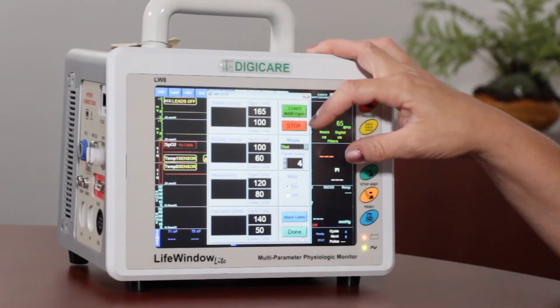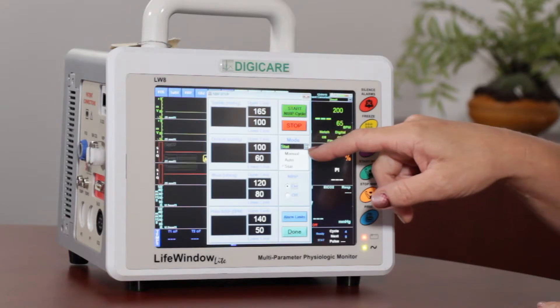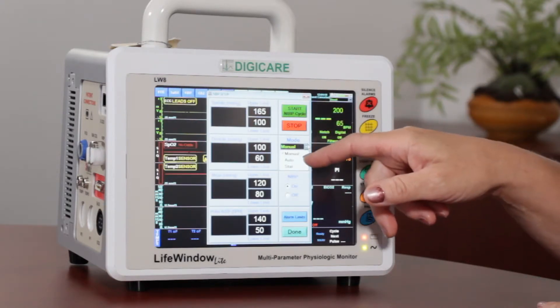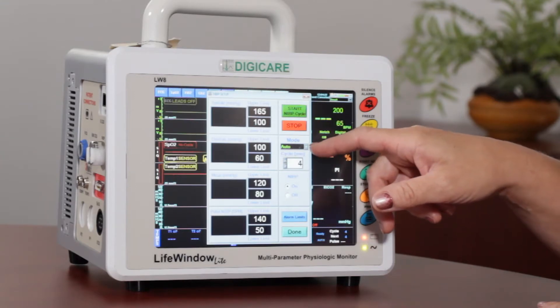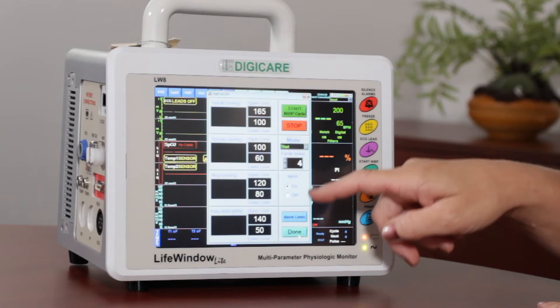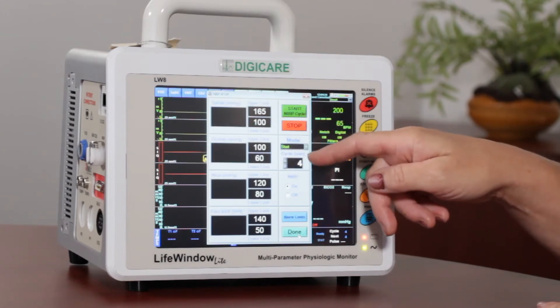You have your start NIBP and your stop, and then here you have your mode. So you have manual mode, which would be one reading. Auto mode — you can tell it to read every three to five minutes, however often you would like. And then we have a stat mode, which would actually give you as many readings as possible in the allotted time chosen.